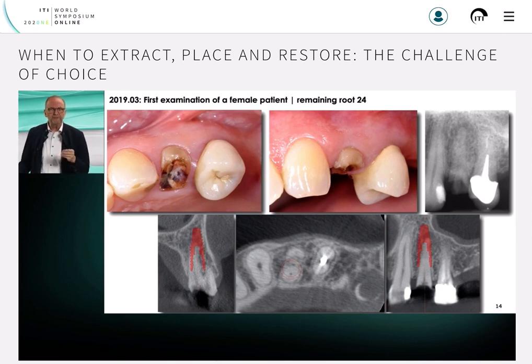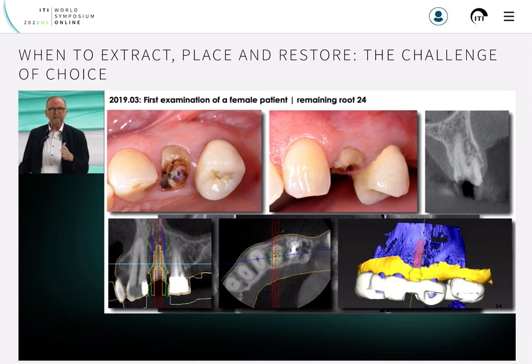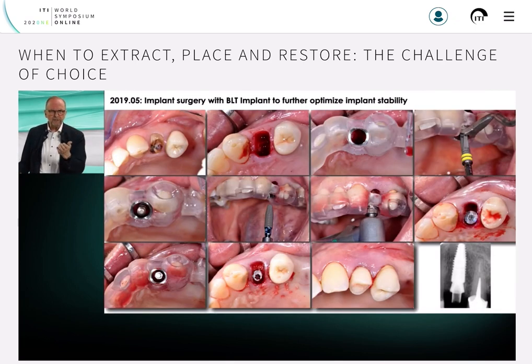Abu Ayyash in Bern. You see we started to do these procedures in 2017, and you see here an ideal case, as I would say, first premolar. You see a thick buccal wall, so I was very happy that we can do the planning fully digital, and then of course a surgical stent is provided, and then you see here some surgical video slides, how the implant was inserted with excellent stability, internal grafting, and then the provisional restoration CAD-CAM produced before the surgery without any occlusal contact, and contact to neighboring teeth is inserted.